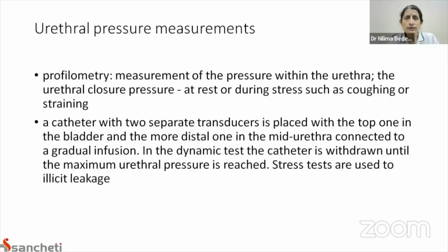There is also urethral pressure profilometry, where these measurements are done to measure the pressure of the closure of the urethra at rest or during stress.